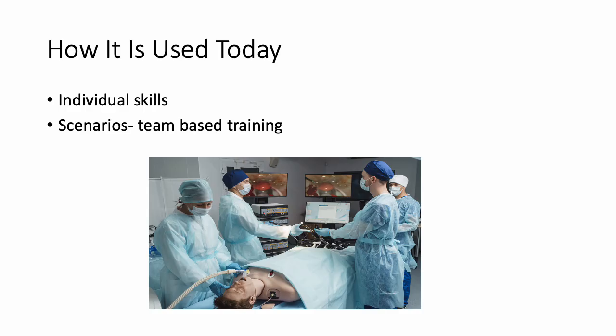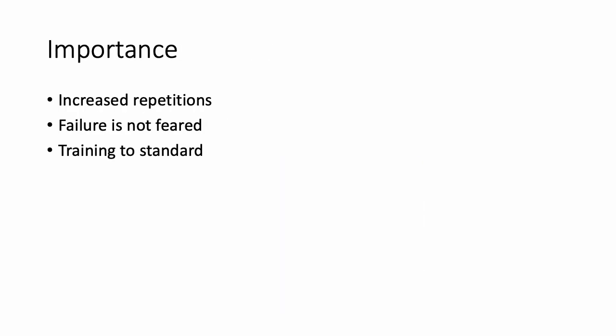Task trainers are most utilized for individual skills like IV access, needle chest decompressions, crics, and pneumothorax. Team-based training is essential and is focused on simulating a real-life scenario to work through. This includes the entire medical team, where there are multiple steps and interventions needed to save the patient's life. There can also be an element of increased pressure by ensuring the steps are conducted within a timely manner and to the standard of care.